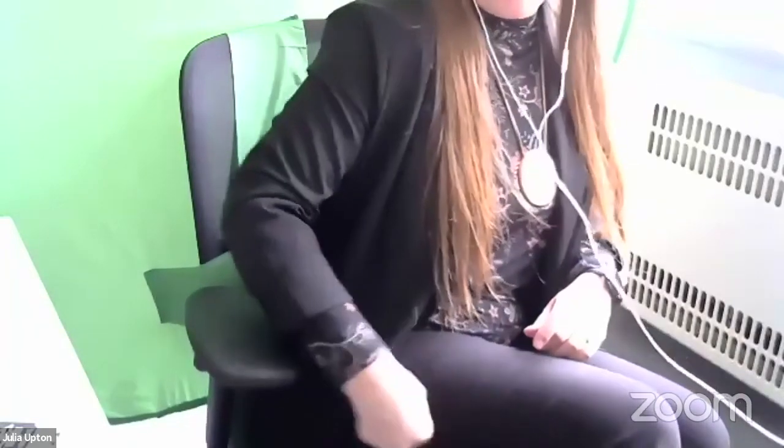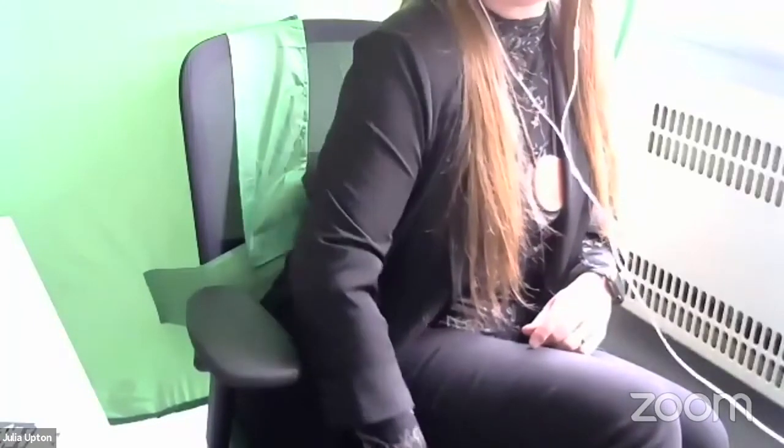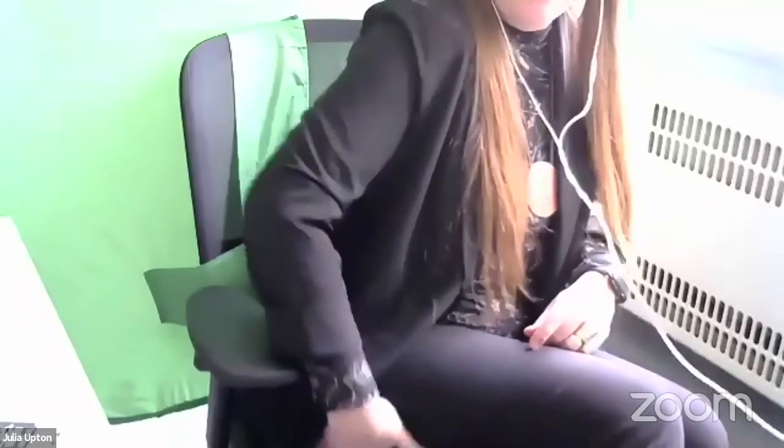So I don't have a lot of muscles on the side of my leg. And then we don't want to go around the back just because there's too much important back there. There's a major nerve that runs down the back of the leg, and so we just want to keep away from that. But in general, for intramuscular injections, the thigh is very accessible as well.